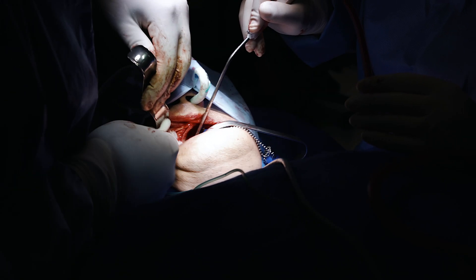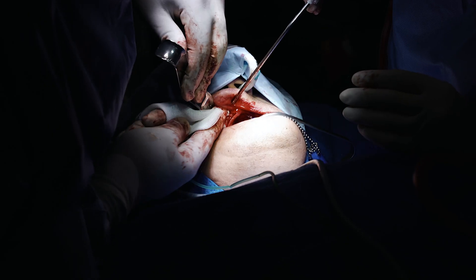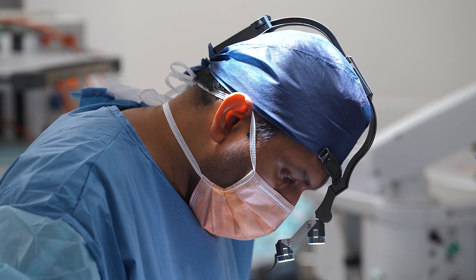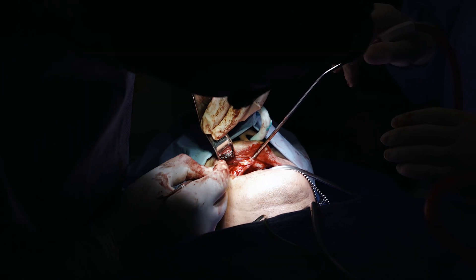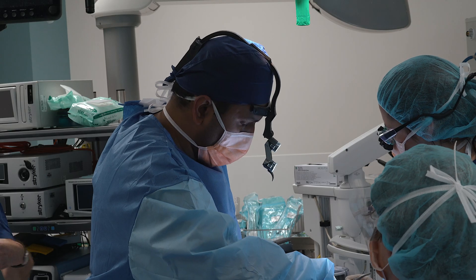At the time of surgery, the main surgical principles are adequate exposure of the maxilla. This involves raising buccal and palatal flaps with a midline relieving incision and two distal relieving incisions.